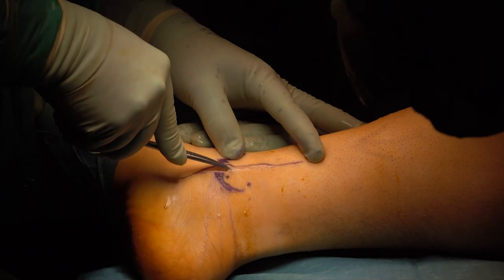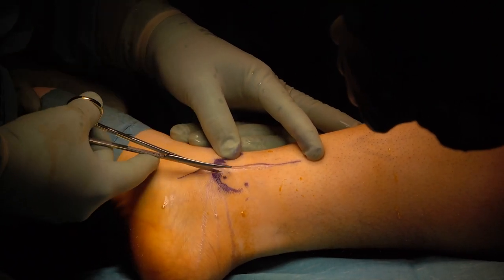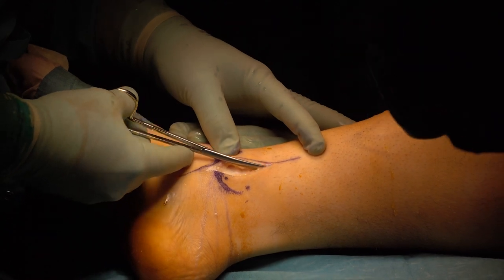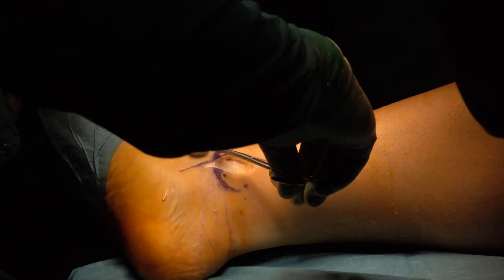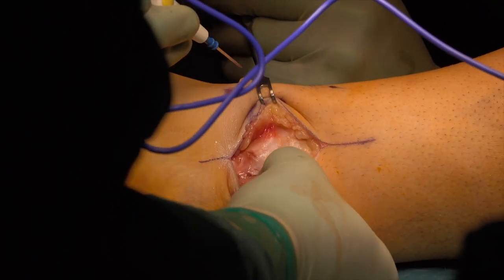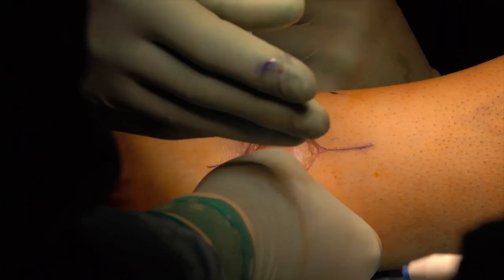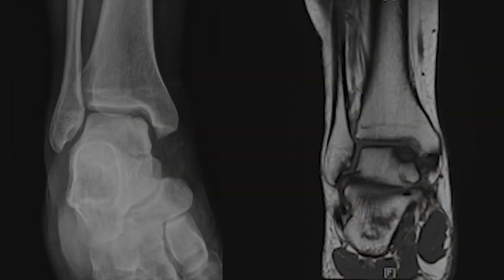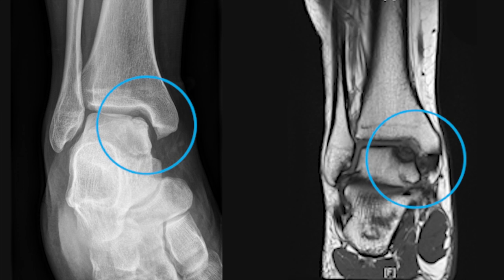In this video, we'll show how an osteochondrial fragment at the medial talus can be fixed with two shark screw allografts. Dr. Jorg Scheidel is operating. The patient is a 29-year-old male with a post-traumatic osteochondritis dissecans of the medial talus. The preoperative MRI and x-rays show a fragment of approximately 20 x 15 x 7 mm.